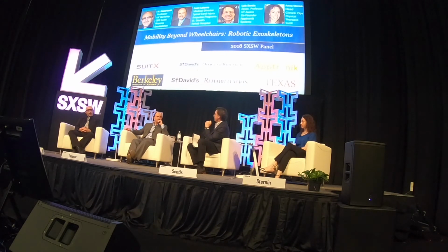Any of you have something to say on that? The question that you are raising, if I may rephrase, is how do you make this machine walk? What is the human intention? How is the human intention measured, to make him walk or stand? There are many ways of doing it. The simplest form is a push button, which Paul had. There are other sensors that you can use to measure basically the tilt. As you tilt, for example, steps are generated. Or we can measure the ground reaction force when you tilt left and right. You can also generate steps.